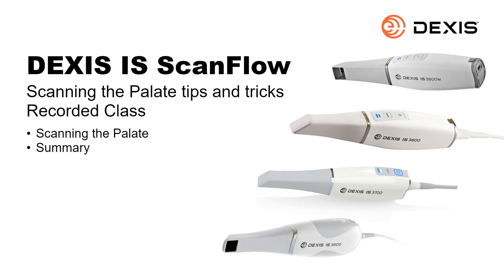The DEXIS IS ScanFlow Scanning the Palate Tips and Tricks Recorded Class. This recorded class is designed for clinical team members. It provides information on how to use the DEXIS IS scanner to scan the palate.